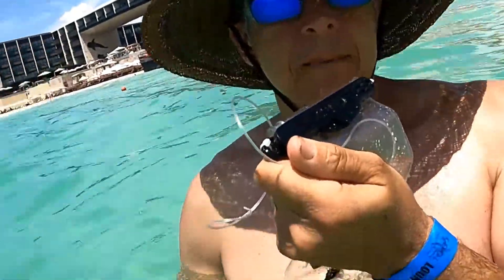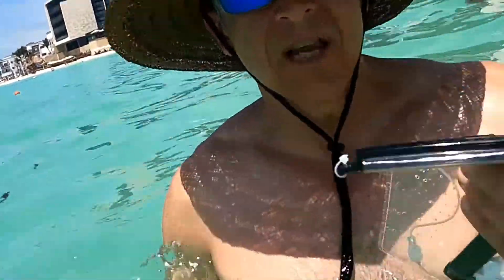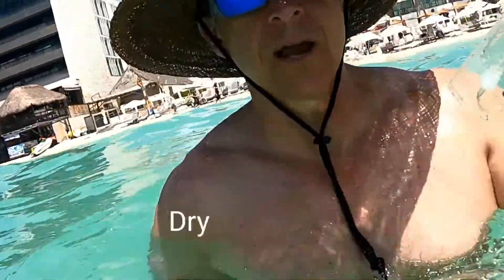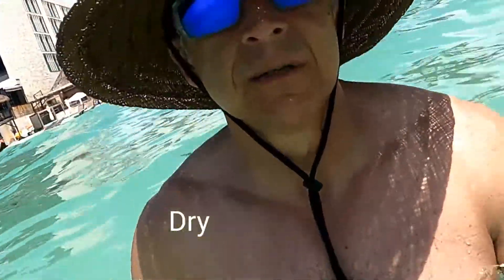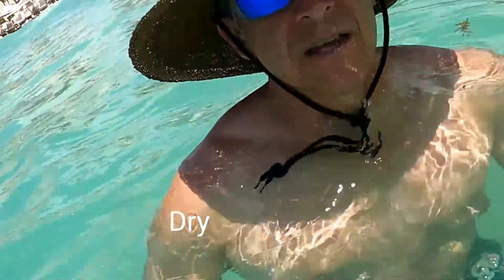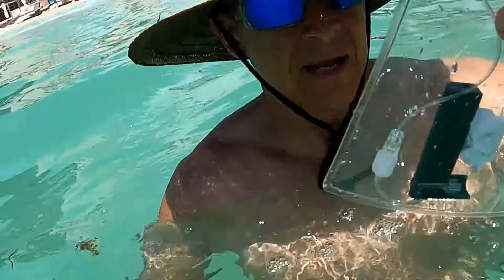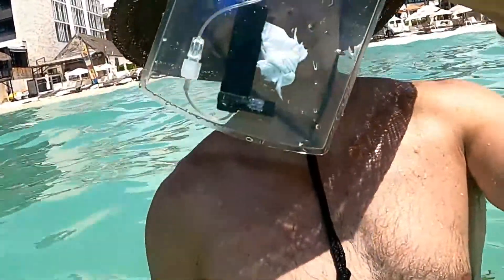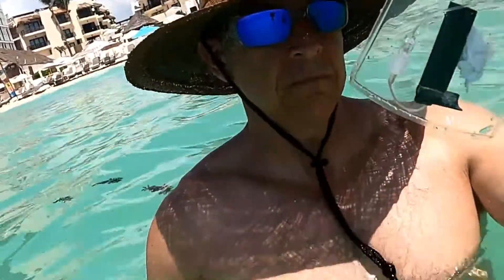I'm at waist-deep water, so I'm just going to do a test here to see if it's going to keep the insulin pump dry. I'm going to submerge it and let's see if I can get any water to stay in or stay out. And at the first test, the bag is dry. So that's interesting — I didn't expect that. Let's do a submersion test.